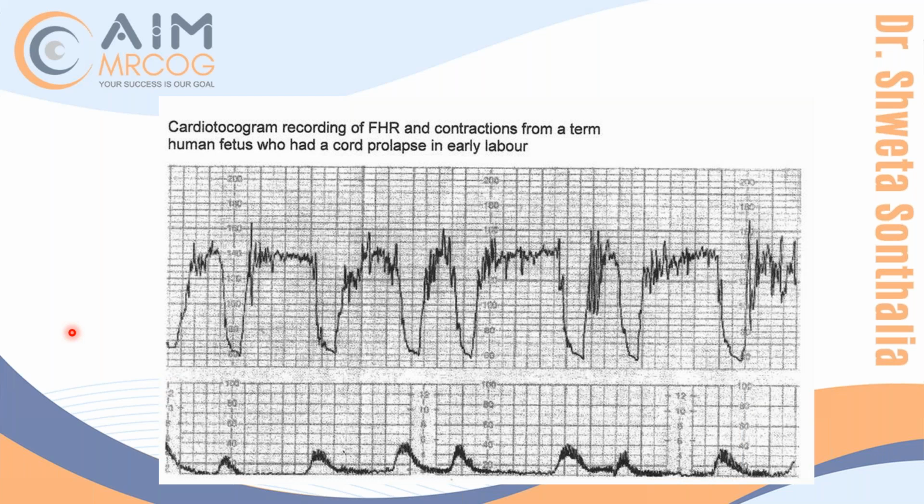If it looks to you like early and late, it automatically becomes a variable deceleration. Again and again, I'll keep telling you, try to make every deceleration variable unless it doesn't fit. But ma'am, the decelerations are all similar. They are not variable.